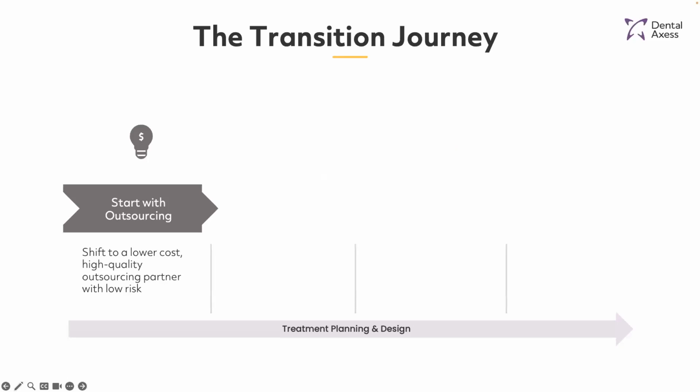Now, through talking to a lot of our doctors out there, we come across some hesitation to evolving the clear aligner planning process in-house. Firstly, we're all time poor. Doctors want to see their patients. You want to focus on the best care for them. Labs are constantly doing the manufacturing and taking care of the workflow there and the processes. But on top of all of that, there's so many softwares and so many aligner companies that it probably feels too hard of a task to undertake. So how does one take a leap like this?